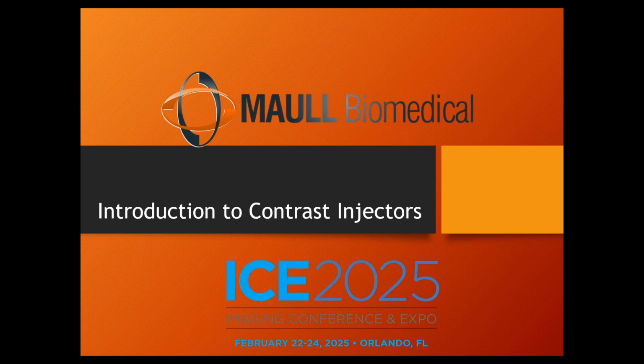So good starting point. Let's say this is my X-ray table. Patient's on the table, we have an X-ray tube up here. I actually taught X-ray for about 6 years when I was with Ditech. So patient on the table, X-ray tube up here, and underneath the table or inside the table, there's going to be some image capturing device. Back when I first started teaching, it was film. Now it's all digital plates. Is there any film left in radiology? I know dental does, but any film left? Anybody still shooting film? I didn't think so. It's all digital. All right.